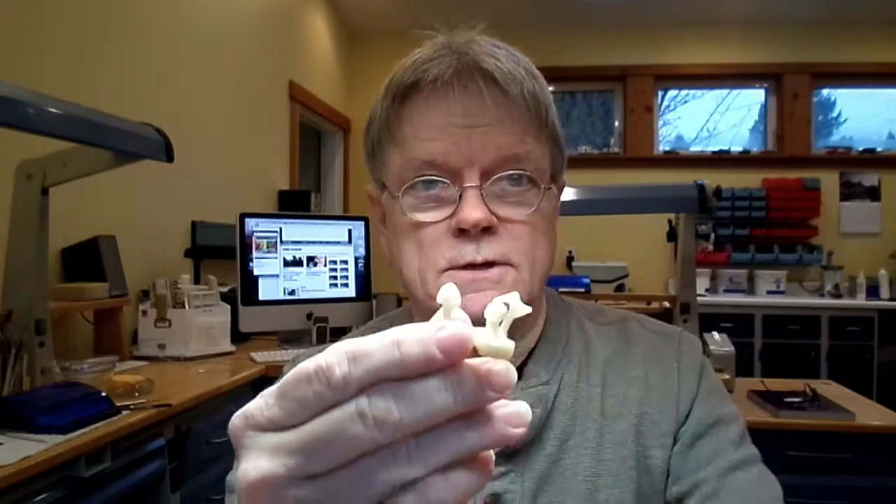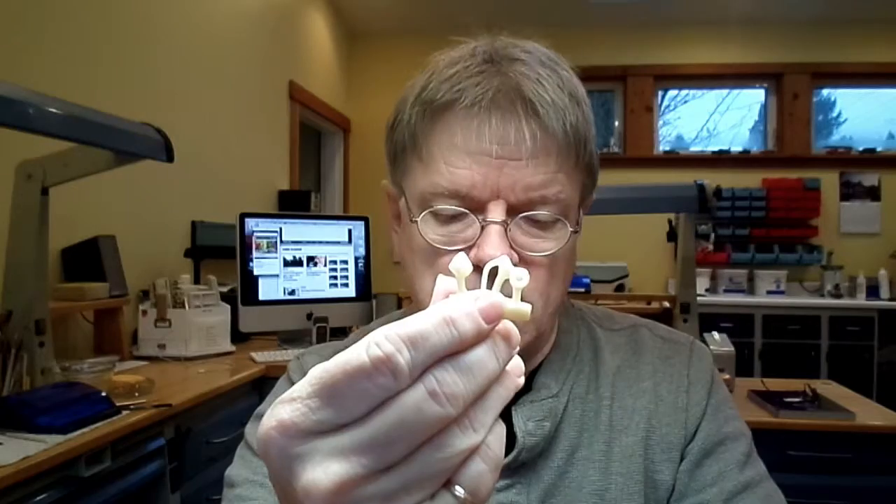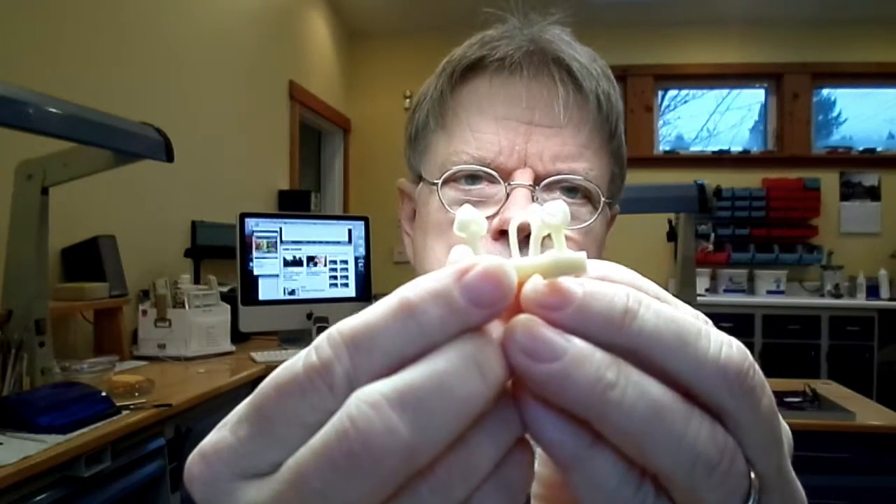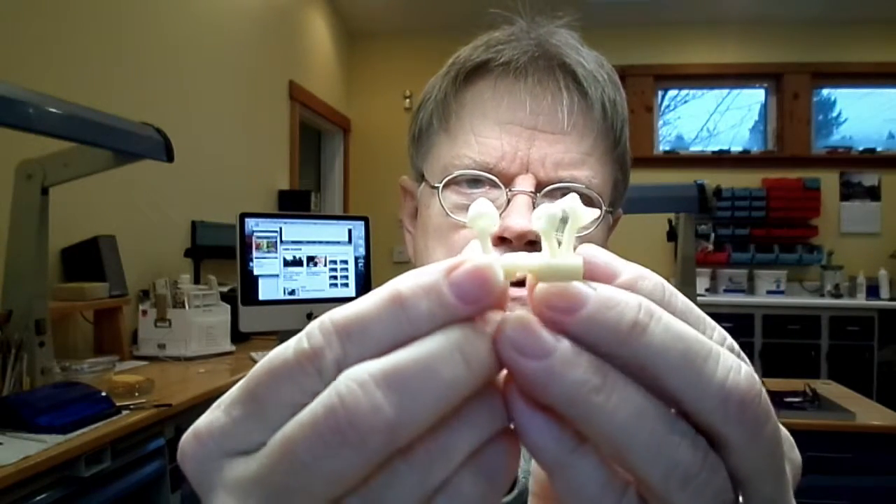For my sprue onto the crown itself, I use wax hard wax thread wire, three millimeter, which I connect in this way. You can see the angle of how the crown is placed.